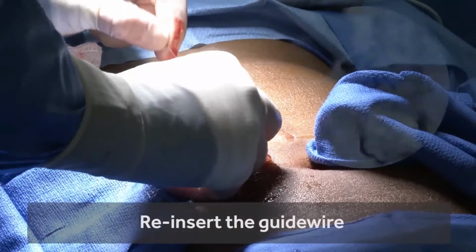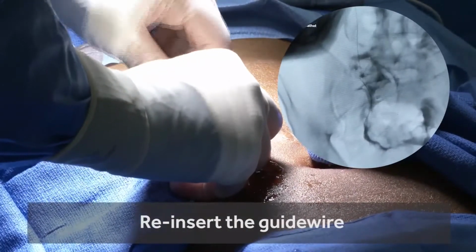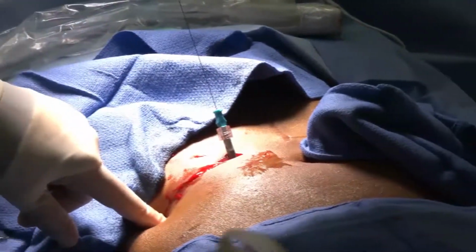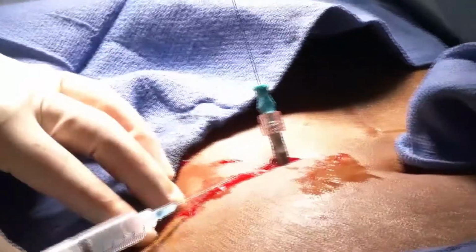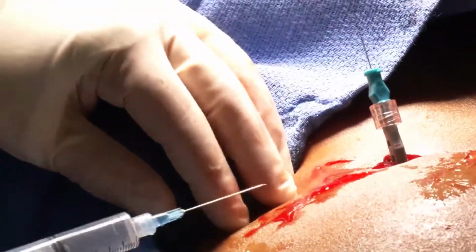Again, we'll reinsert the guide wire, and then we'll reconstruct the micropuncture set so that the outer, either 4 French or 5 French, piece is in the peritoneum. And now again, we'll make the track that the catheter will use to exit.